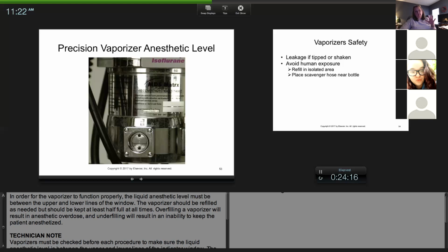But if you go in that room, remember the amounts: in open air, ISO can get to 30%. So ideally you would maybe put a fan in there. Not everybody has a window in the room that has the machine, but you need to ventilate and get out of the area for at least a half hour or so. If you're filling this, hopefully no patient is attached, because you can't really leave a room with your patient in there. But you definitely want to make sure, because again, you could pass out, you could become woozy. Sometimes people get nauseous by the smell. So you do want to be careful.